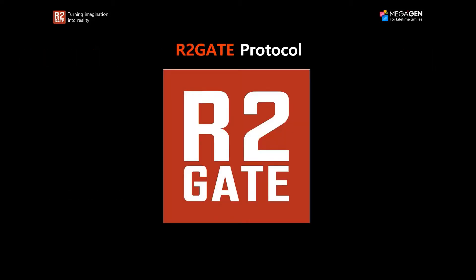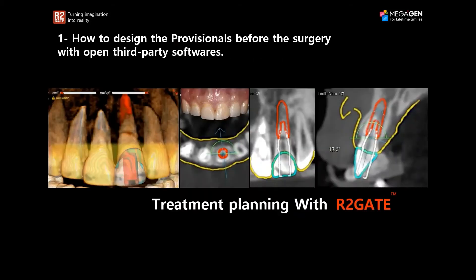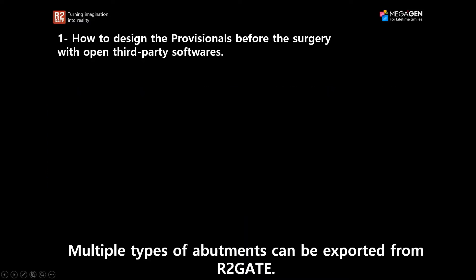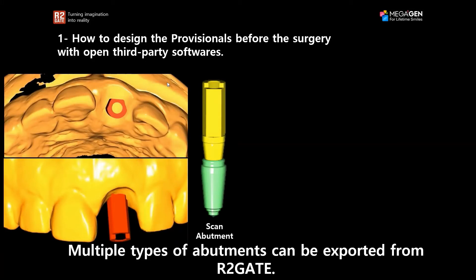Let me show you how we could do that with the R2GATE protocol. How do we design the provisionals before the surgery with open third-party softwares? In the R2GATE software, when you're treatment planning your implant, you have the option to export a lot of different types of abutments from the software. These different types of abutments could be either a scan abutment, and you could use that scan abutment and model in order to be able to design the crown before the surgery.